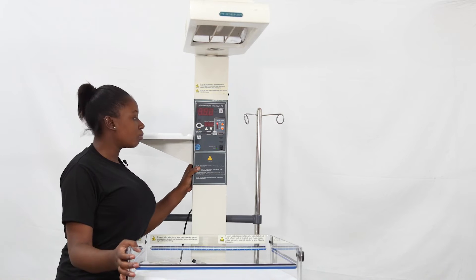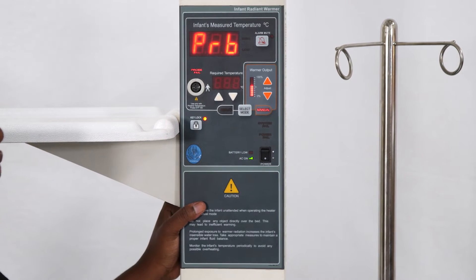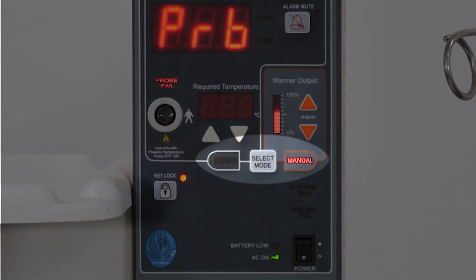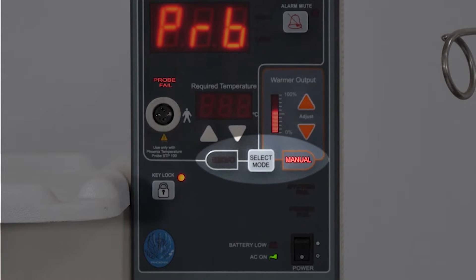The machine has two modes. You can use the machine in automatic mode, usually called servo mode, or you can use it in manual mode. At the moment it is in manual.